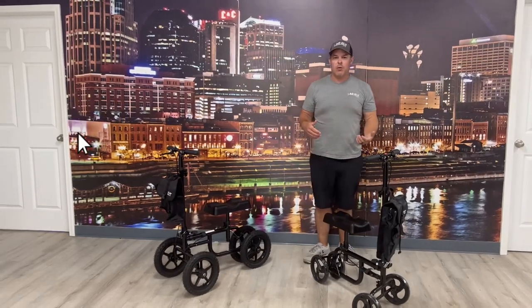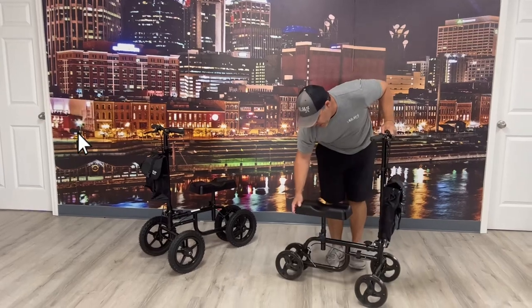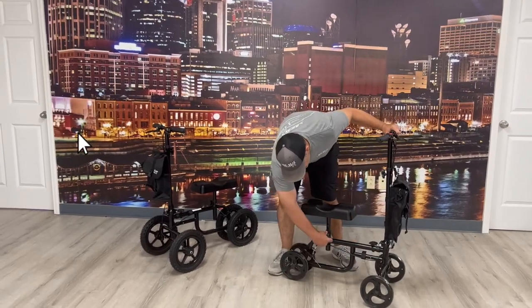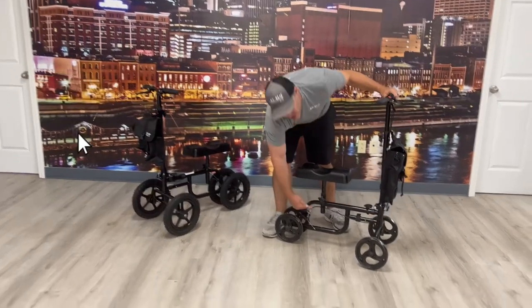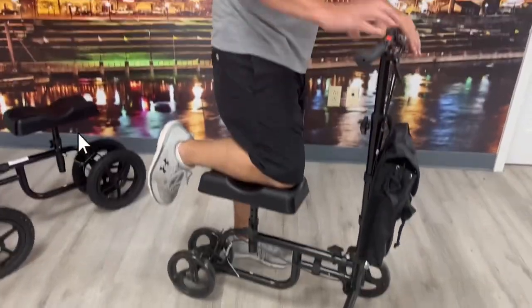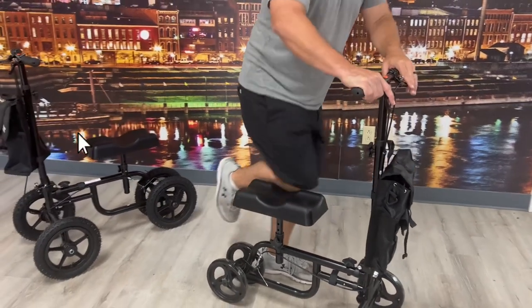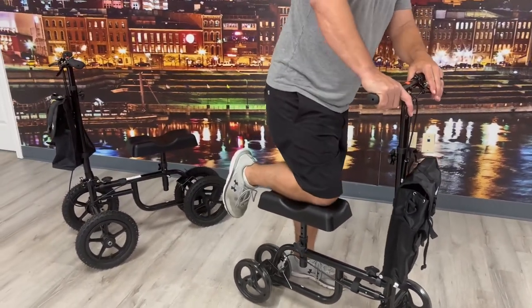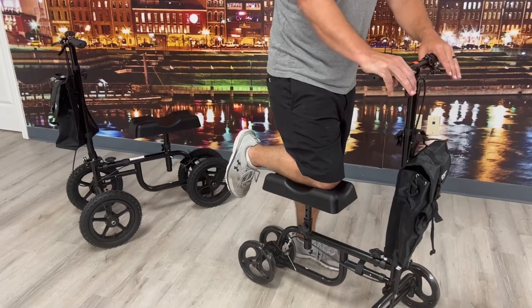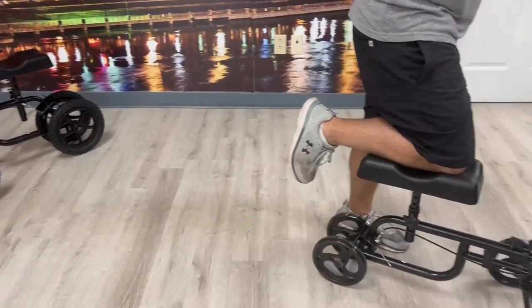I want to show you how they disassemble — they're very easy and they work the exact same way. There's a knob below here that you can adjust to set the seat to the proper knee height. You want that height right — you don't want your knee bent too low or raised too high. You really want that knee pad at a good height where your hips feel level, so you can push around comfortably.